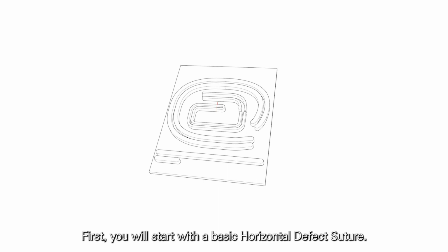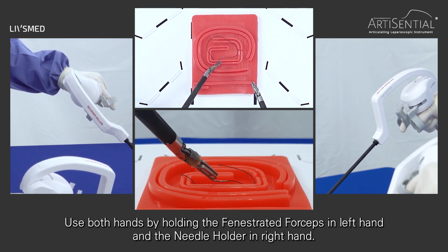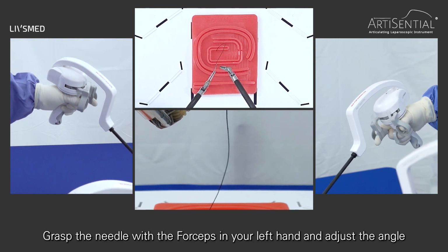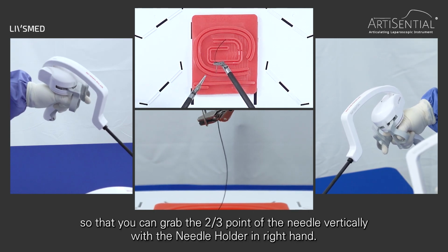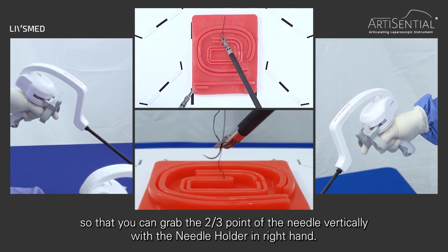First, you will start with a basic horizontal defect suture. Use both hands by holding the fenestrated forceps in the left hand and the needle holder in the right hand. Grasp the needle with the forceps in your left hand and adjust the angle so that you can grab the 2/3 point of the needle vertically with the needle holder in the right hand.